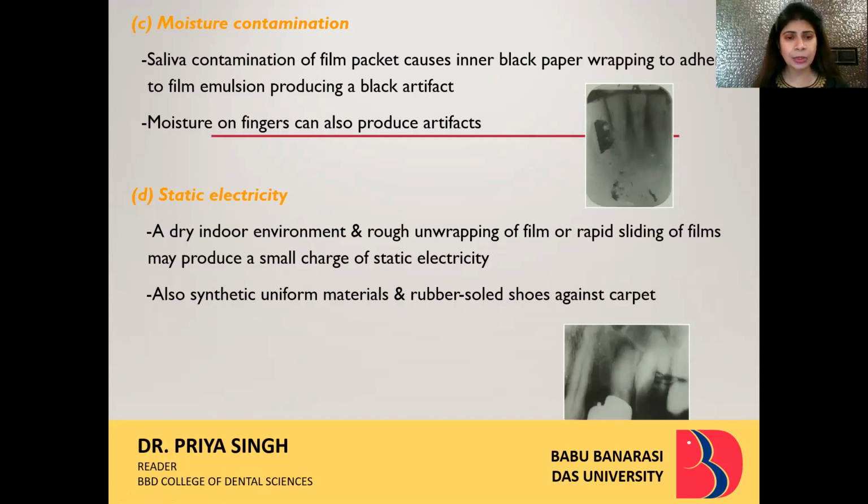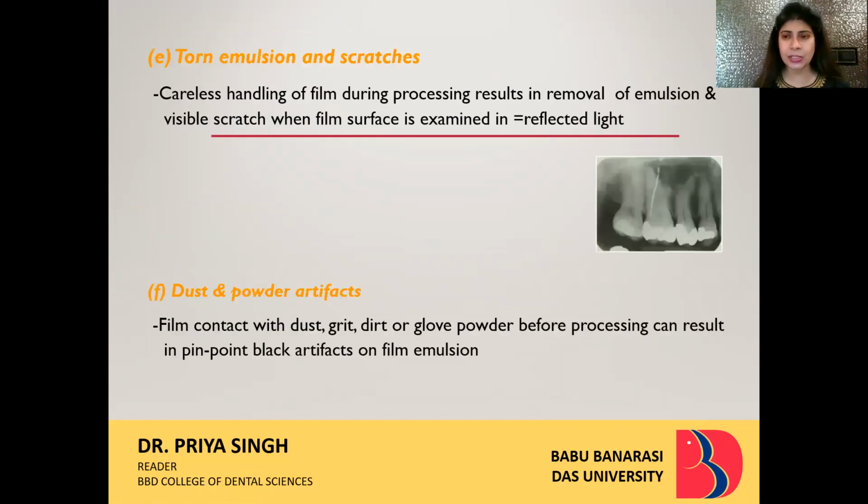Static electricity. A dry indoor environment and rough unwrapping of film or rapid sliding of film may produce a small charge of static electricity. As you can see in this particular image, this static electricity can lead to black color of electric light impression. Also, synthetic uniform material and rubber sole shoes against carpet. So static electricity can be produced, which can be avoided while the final image is being procured.